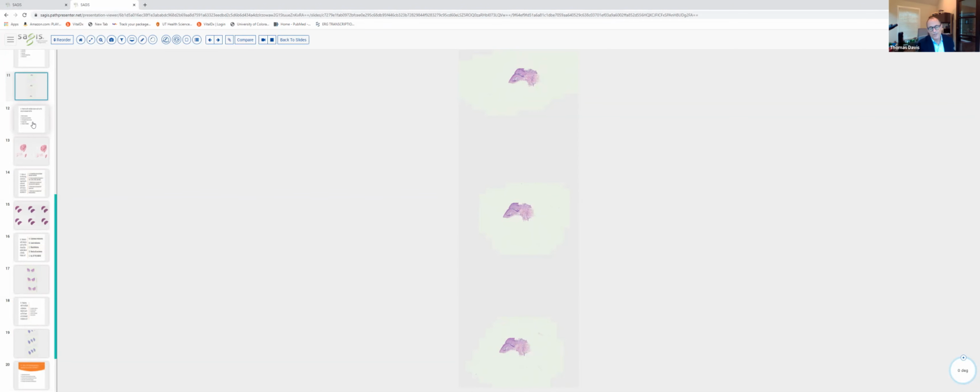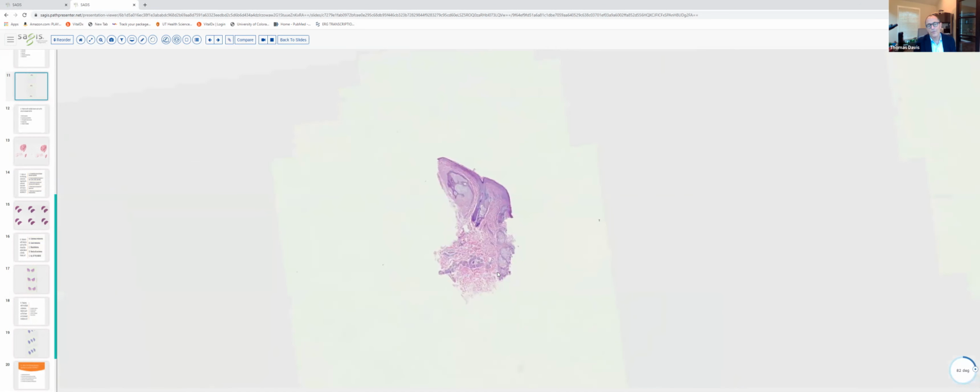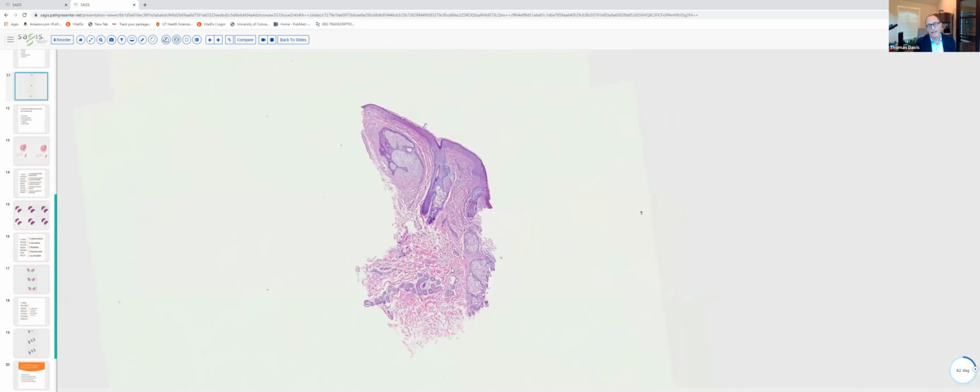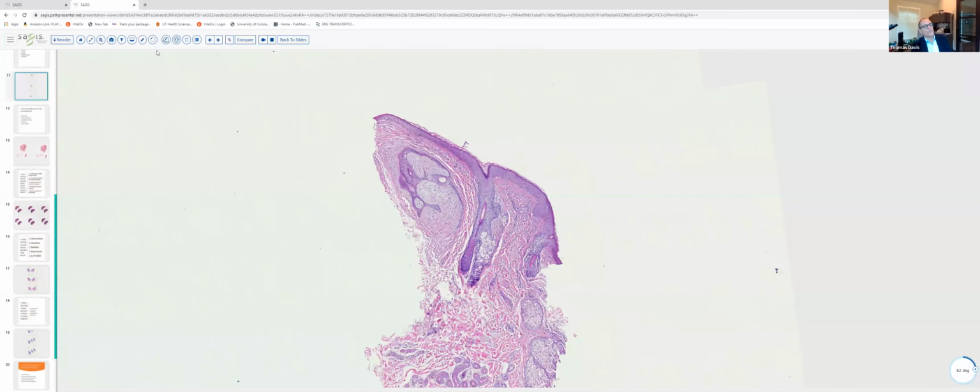And slide number 6 was a very small biopsy. We'll go ahead and tilt it, and we're going to have to move into high power to say much about this. This was a punch biopsy. It was from the head and neck. You get a clue for that location by the presence of these large sebaceous glands and an increased number of follicular units. These are vellus hair follicles. And the area of interest, of course, is in the upper reticular dermis on the left half of the slide.